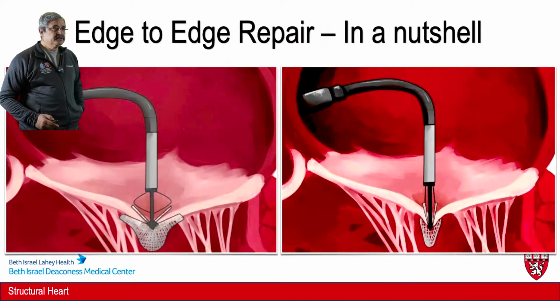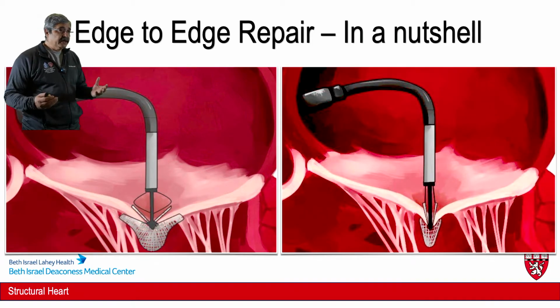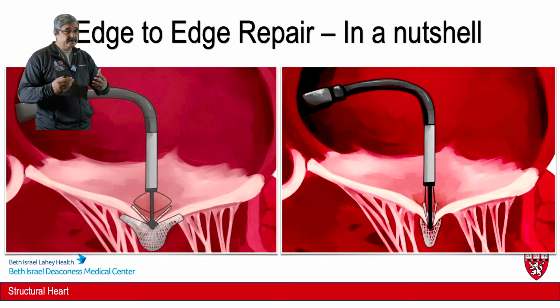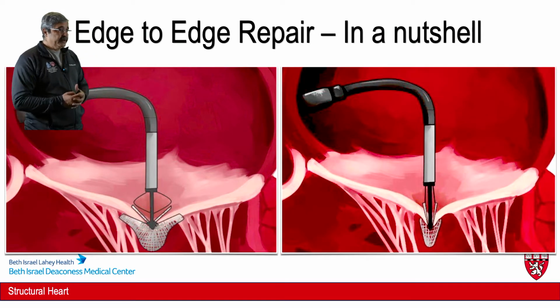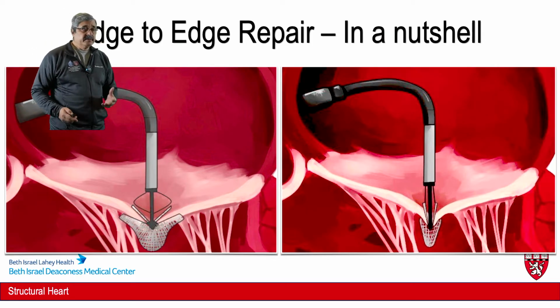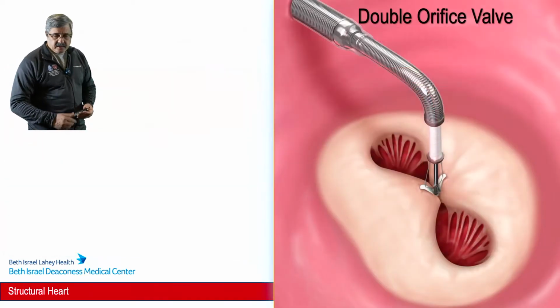Having said this, let's get back to the edge-to-edge repair. So in a nutshell, edge-to-edge repair consists of bringing both the edges of the mitral valve, that is the anterior and posterior leaflet, together and tying them up in the middle. Now this was traditionally done with surgery, but now this is being done with the transcatheter approaches, and that's exactly why we are here.